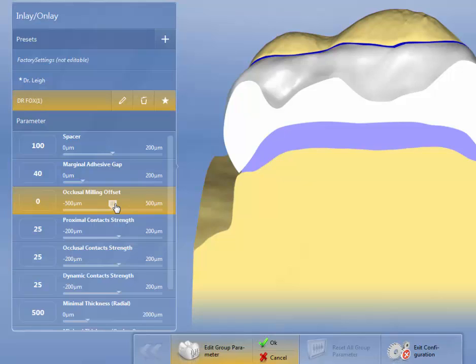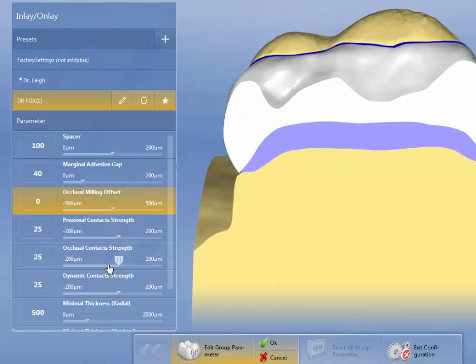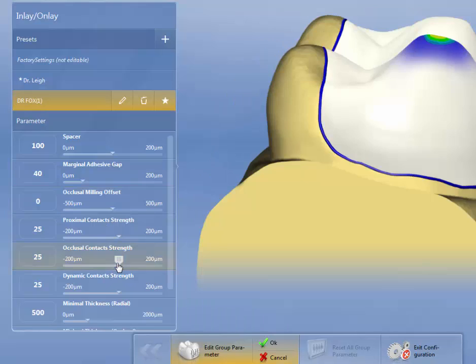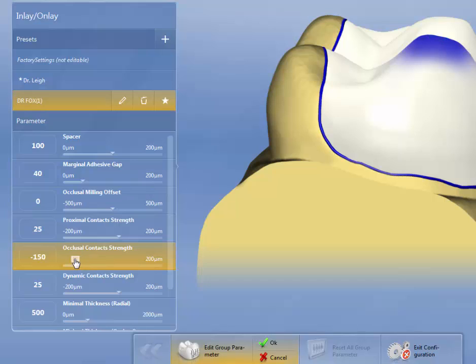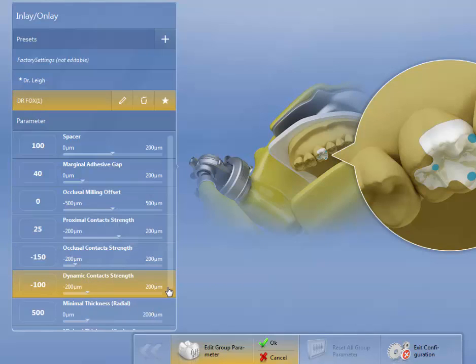Occlusal milling offset, I'm going to set that to 0, just like we explained it before. This either adds or takes porcelain away. So it either does not take as much porcelain away or it takes more. So I'm going to set that to 0. Proximal contact strength, I'm going to leave it at 25. Occlusal contact strength, I'm going to set to minus 150. Dynamic contact strength, I'm going to turn that to minus 100. So these are the same settings as we had for the crowns.